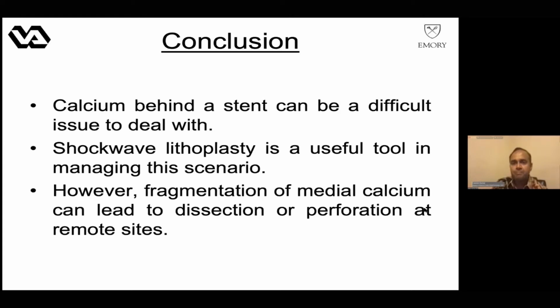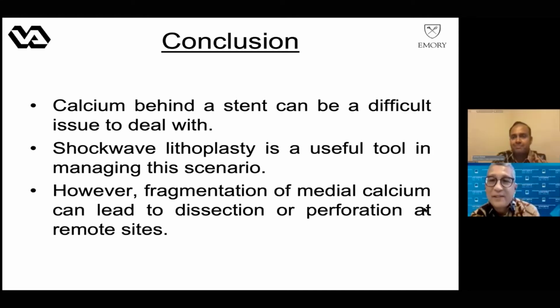Thank you. All right, great presentation. So I think there's many things that can be discussed in here. So we still have 10 minutes for discussion. So I believe that Gautam already chose a shockwave lithoplasty in this difficult scenario. So I don't know, what about in Japan, Dr. Sugi? Do you do lithoplasty or shockwave in this kind of situation?